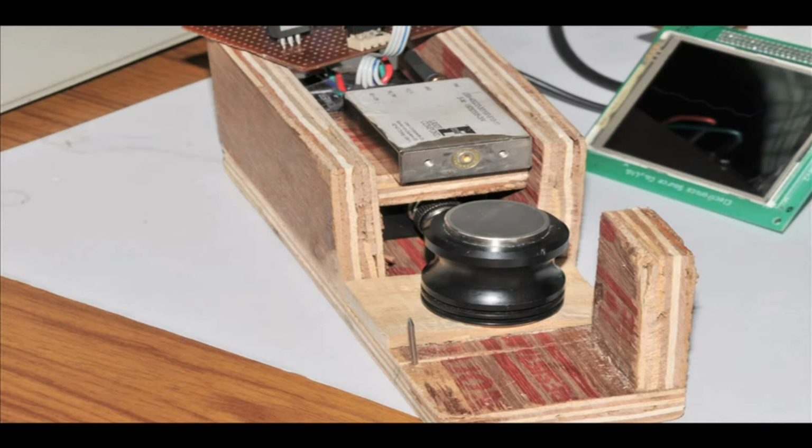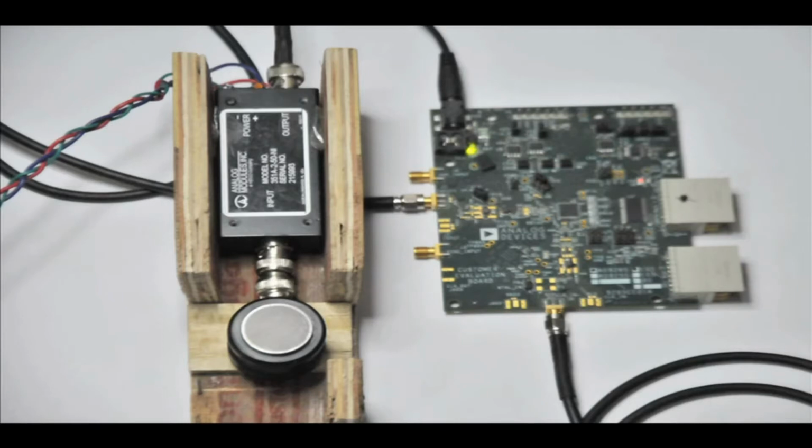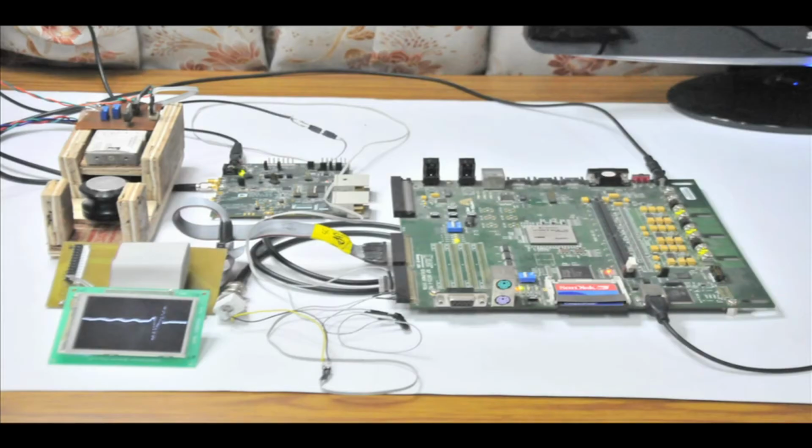The piezoelectric converts the acoustic wave generated in the sample to an electrical signal. The electrical signal is feeble in nature and is amplified using a low noise amplifier. Following this, the signal is sampled and digitized using an analog to digital converter. Multiple frames of the same signal are acquired and averaged to reduce noise. This processing of the digital signal is performed on an FPGA platform.